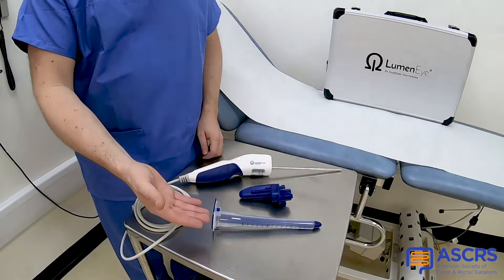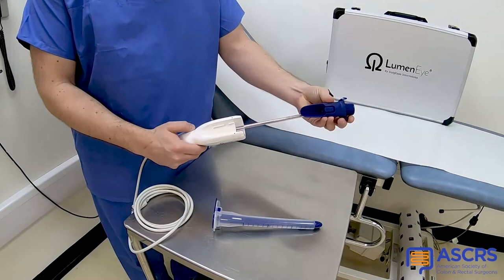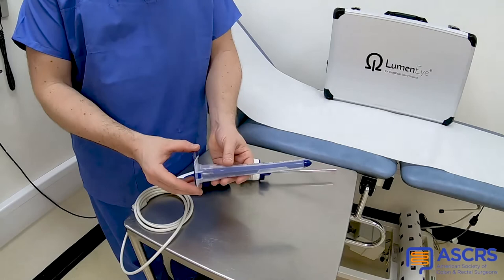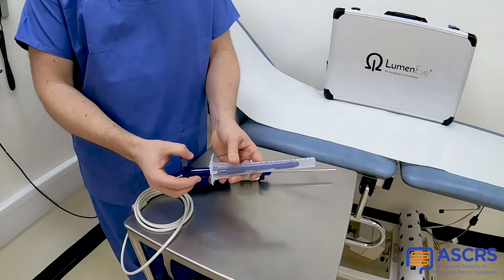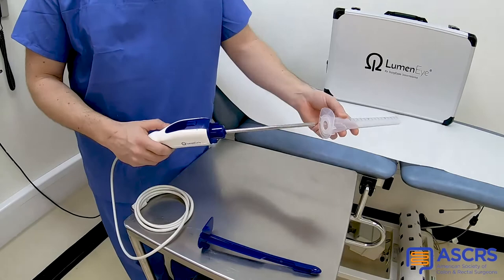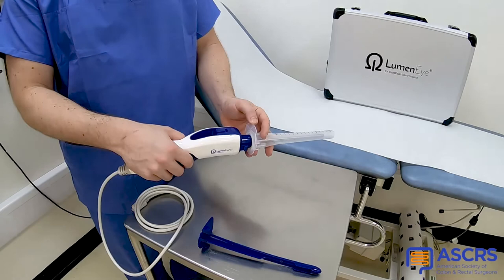Assembly is straightforward. The manifold is placed onto the handpiece and pressed to click. The outer sleeve with introducer is inserted into the patient. The introducer is removed — it is important to note that the sleeve is kept with the lip pointing upwards. The handpiece can then be inserted and insufflation can commence once the manifold and air seal make contact. The device then mates with a positive click.